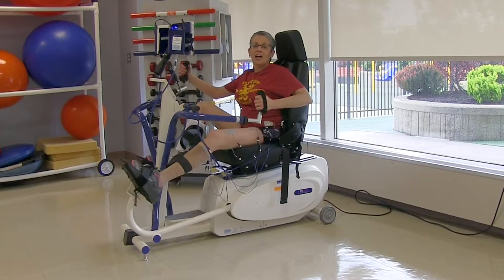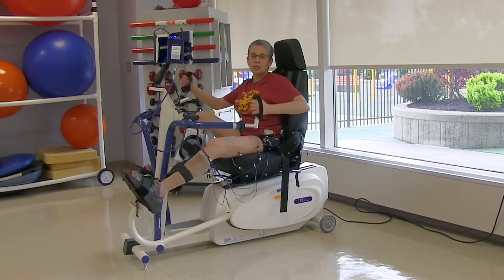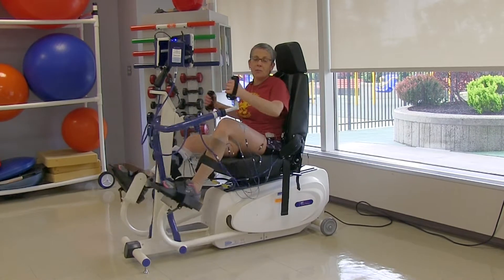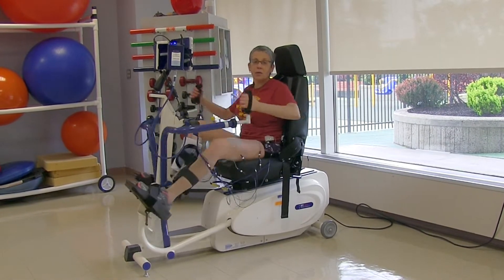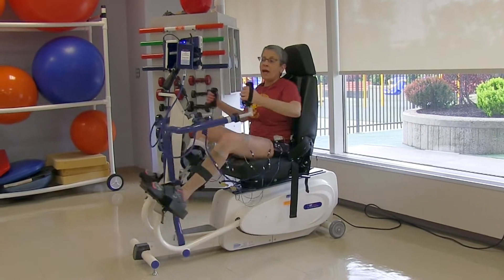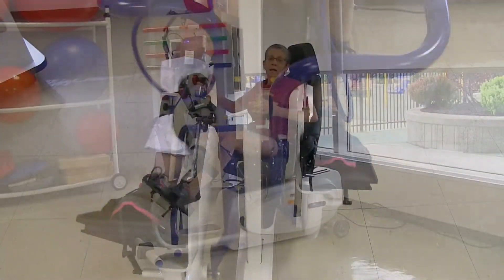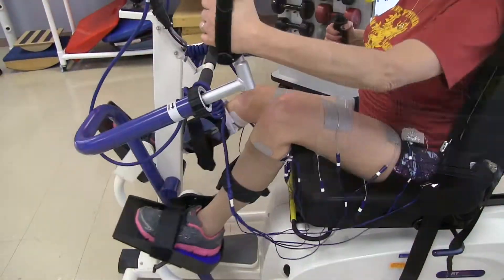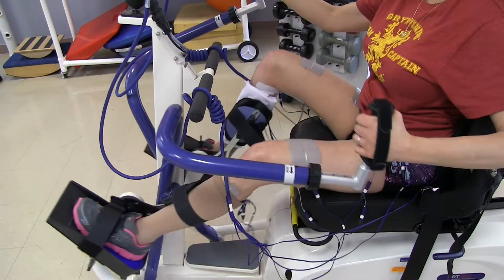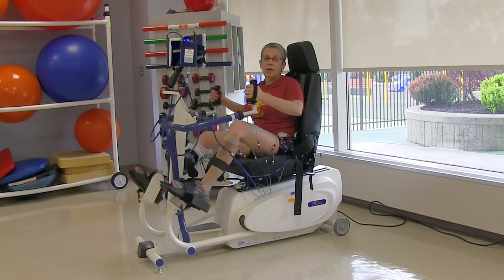Hi, I'm Beth and I'm on the FES-200, a functional electric stimulation machine. It is a recumbent stepper that is particularly helpful for me. I'm a paraplegic from the waist down and this is a great machine for me because it helps me move my legs, but it also gives me an upper body workout as I'm moving my arms as well.